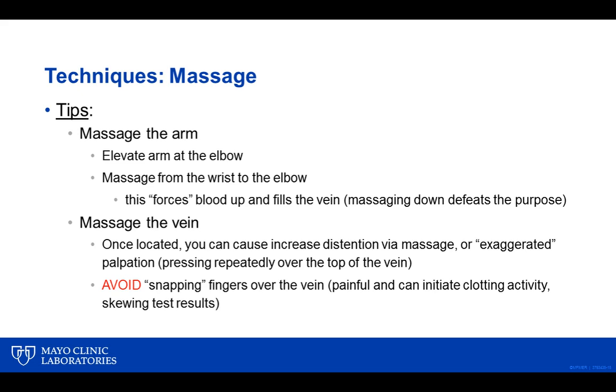Now, you can certainly use exaggerated palpation. In other words, you can push aggressively, like you're palpating the vein. You found it, but what you're doing is stimulating it a little bit, causing it to distend a little bit, but you're not doing that snapping with the fingers. That's something that we should avoid doing.